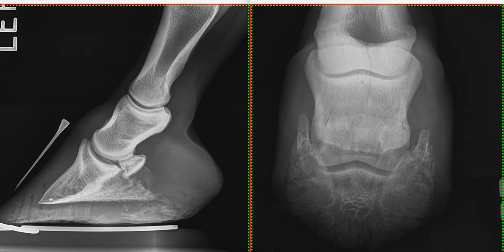I'm going to really concentrate on the navicular bone. We're going to start by looking at our lateral medial view and our dorsoproximal palmarodistal oblique views. When I'm looking at a lateral medial view, the first thing I like to do is assess how lateral it is. We're nice and straight through our joint spaces here and here. Our navicular bone flexor cortex is one white line rather than two, so that tells me the flexor cortex is nice and superimposed. So I'm happy that this is a good lateromedial view.